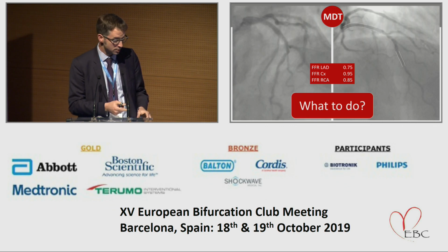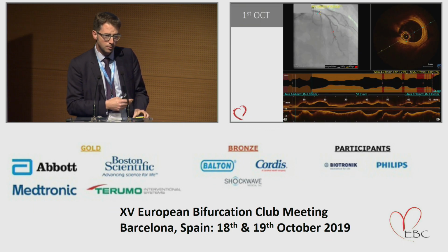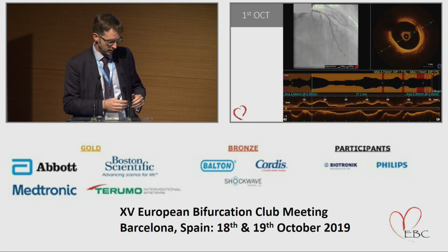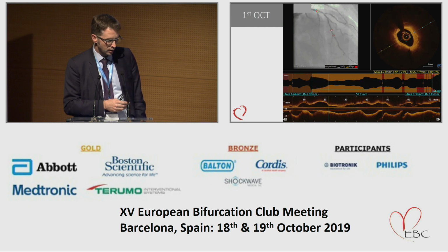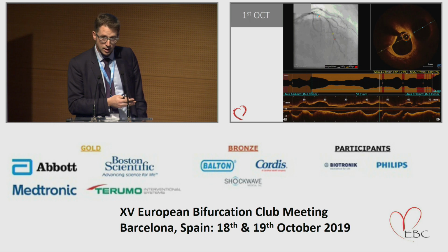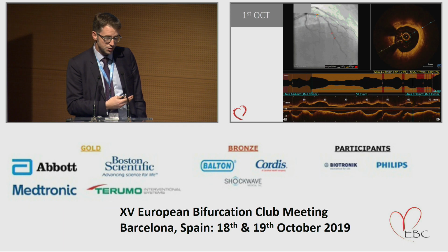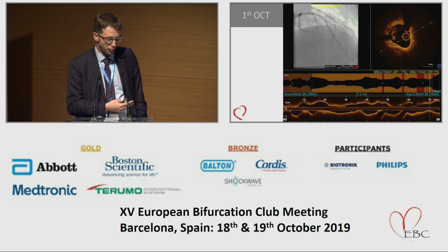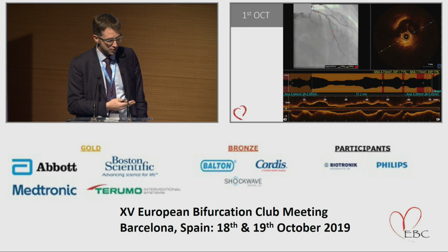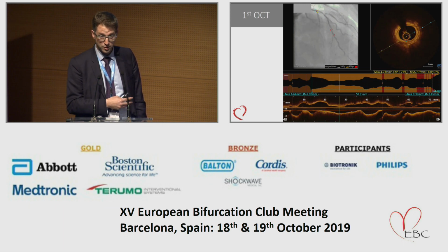Maybe if we want to add to the comment, I could show you the OCT, because that might add some thought. This is a preliminary OCT without having undertaken any predilatation, and I think it is very instructive. For me, stent failure is the one place where I can stand confidently and say imaging is absolutely mandated, because without understanding why a stent has failed in the very first place, we really have no idea how we're going to overcome the problems. Having undertaken this OCT, it becomes quite apparent this is complex disease in a complex scenario, albeit the bifurcation is probably the least of our worries.